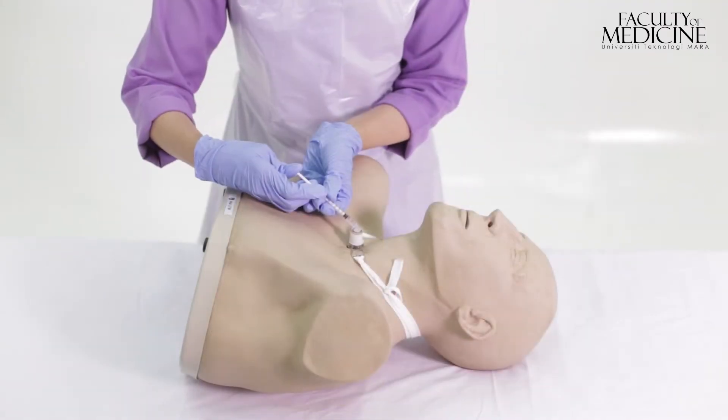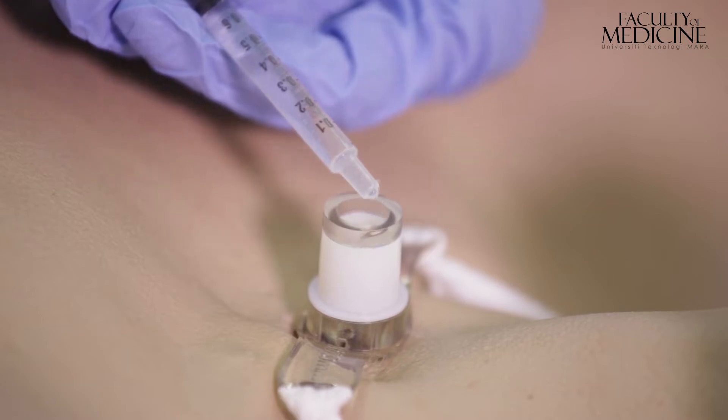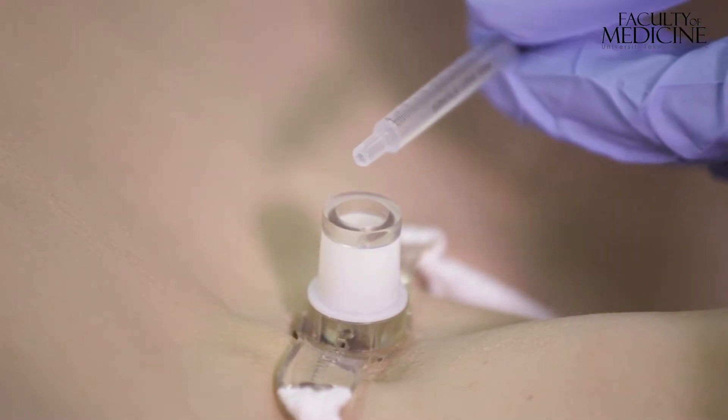Sodium bicarbonate is instilled drop by drop into the inner side of the tracheostomy lumen.